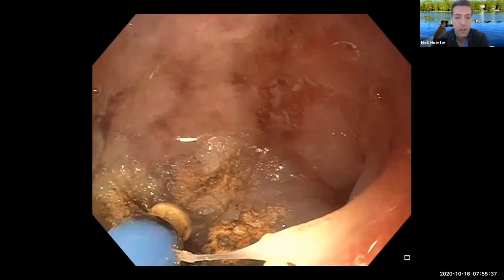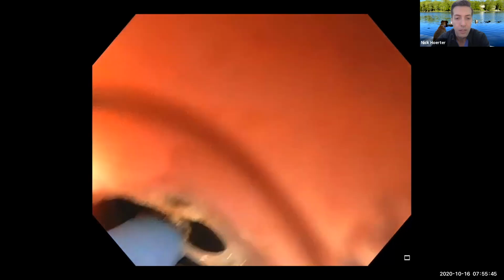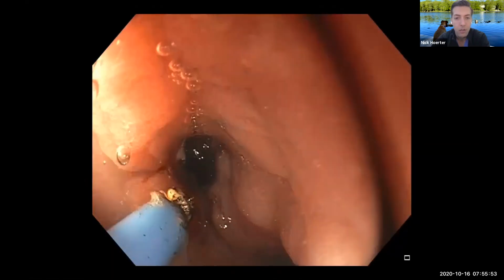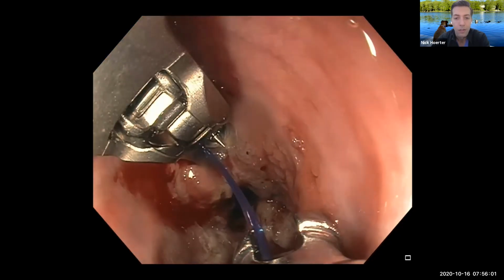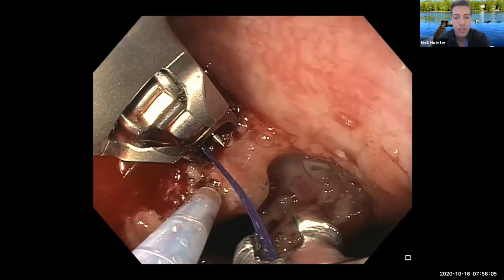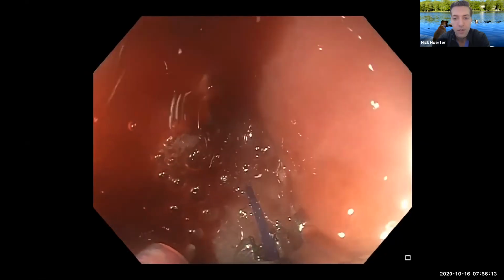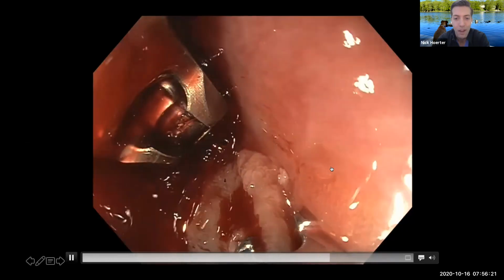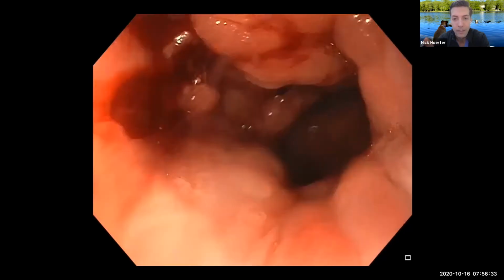So on her second endoscopy, this whole outpouching and tract was treated with circumferential APC, as you can see here. The idea being that this would aid in tissue apposition for fistula closure. And then again, endoscopic suturing is employed to close this whole area off. So this is the tissue helix, pulling tissue within the suturing device. And then this suture is fired through the tissue. There are several more steps that are not well documented here because it goes in fast motion, but there were 2 interrupted sutures placed. And this is the suture being cinched down. The final result is that that area is completely closed off, so the only opening is the sleeve opening there.